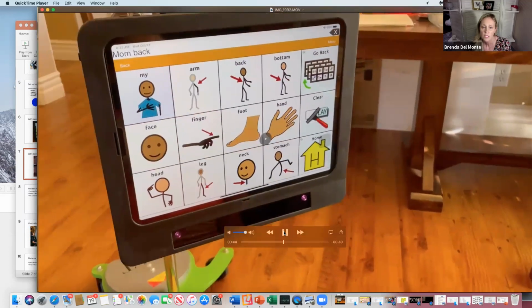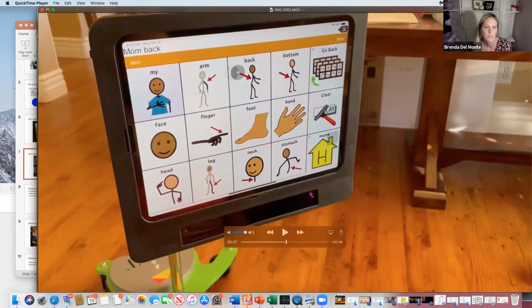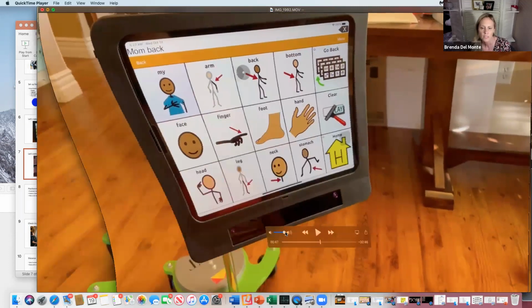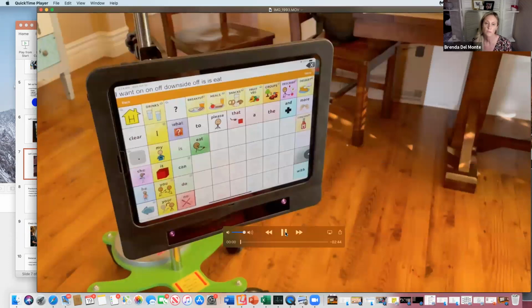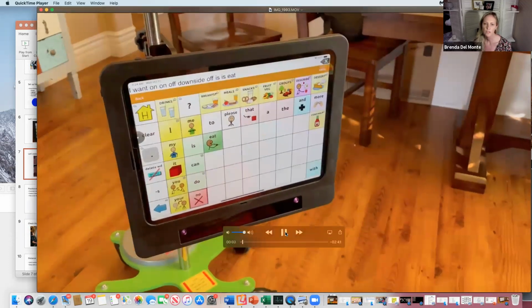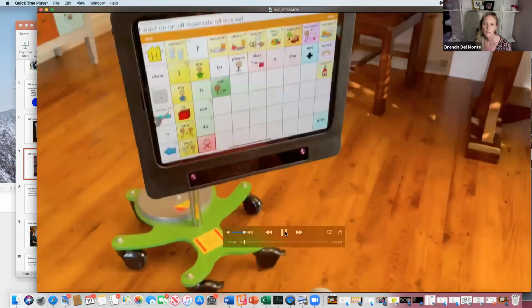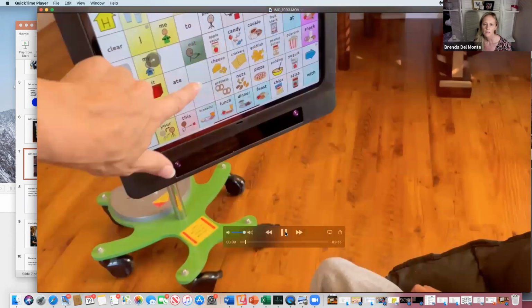So that was touch chat on the 15 with it. And then just for time's sake, I tried it with the 60 since she is so good with small buttons. And this is an iPad Pro, so it is 12 inches. You're in food right now. I wonder why food is empty. Hold on, let me try that again. Eat. There we go. What do you like to eat?